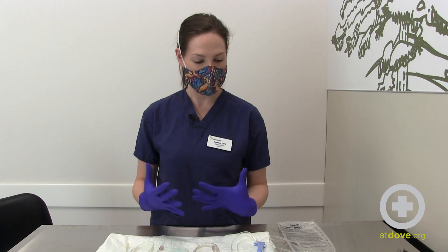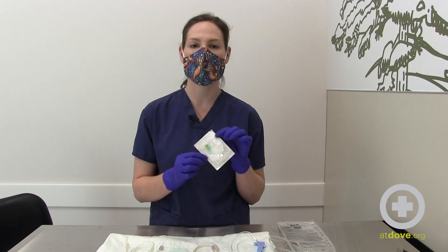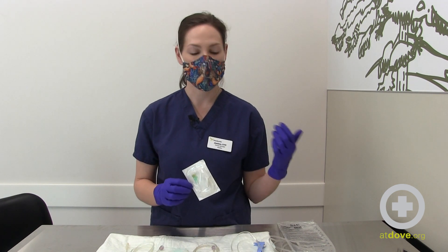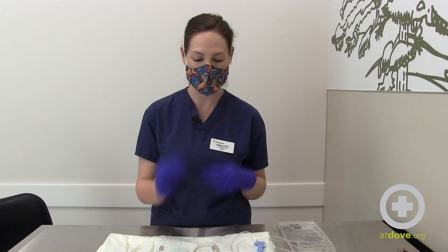Hi, I'm Jessica and I'm one of the CVTs and training specialists here at Dove Lewis. Today I'm going to do a technician hack for you — we're going to turn a T port into a Y set. We have Y sets downstairs but sometimes we don't, so you can make a T port into a Y set so that you can run your patient's fluids and maybe some other fluids or a CRI at the same time.